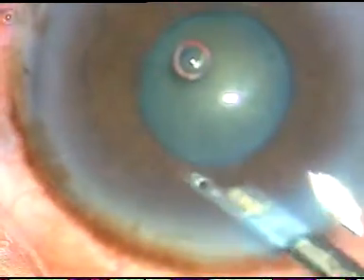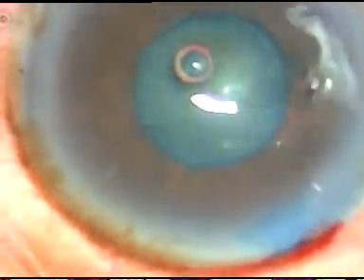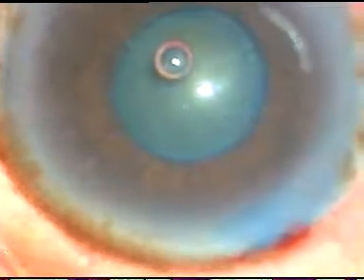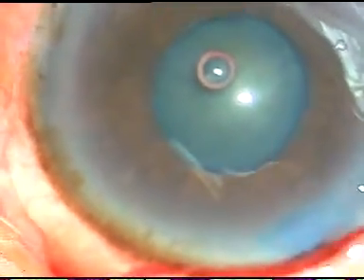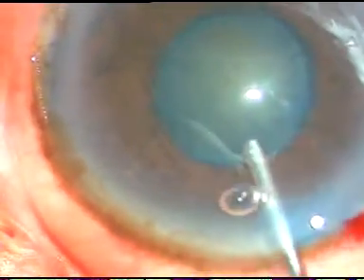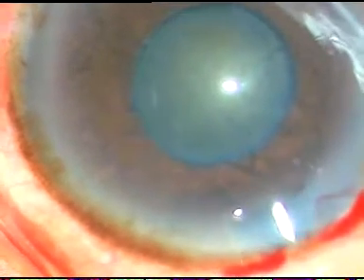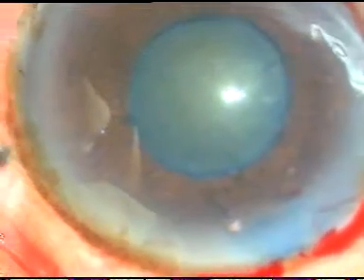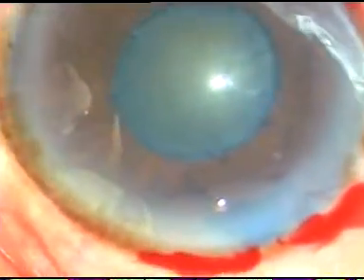The dye is washed out and now viscoelastic substance 2% HPMC is injected into the anterior chamber. HPMC is good enough to protect the corneal endothelium. If we do the surgery very gently and if we maintain a safe distance from the corneal endothelium, this is more than enough to protect the corneal endothelium.